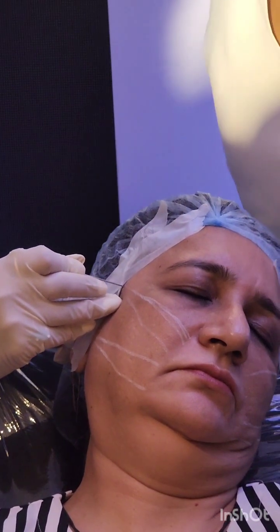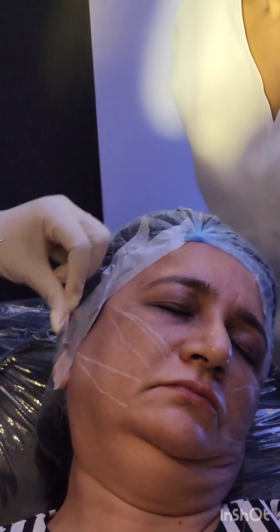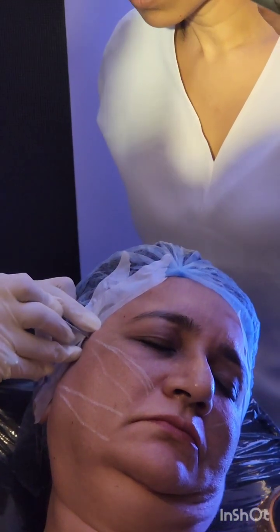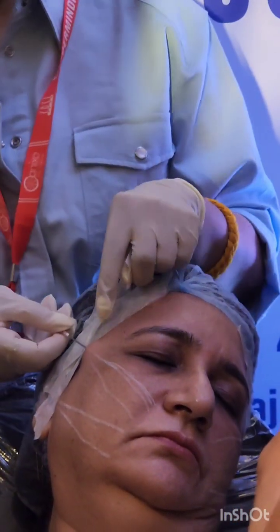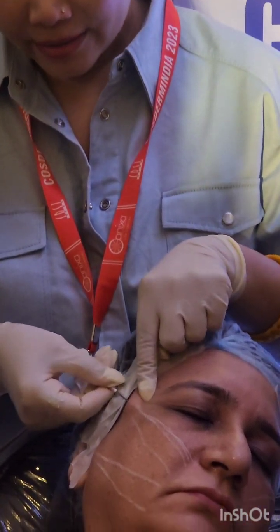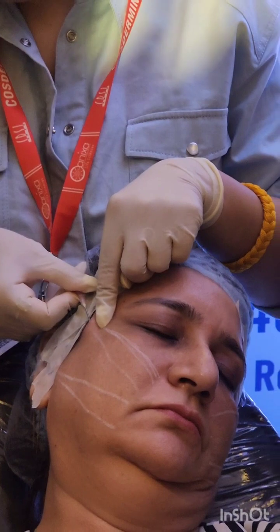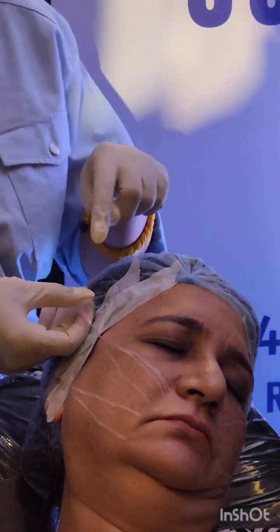Aditya, take out the needle and thread. I think it completes 7 minutes. Okay. Now create a little bit of track. Now I'm able to lift the skin, so I'm in the right plane. Okay. So I'll create a little bit of track on both sides. Not required, but it just eases it.